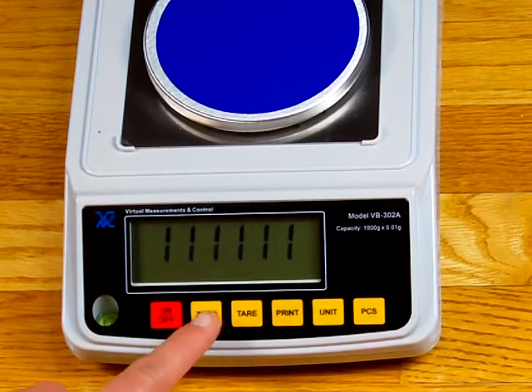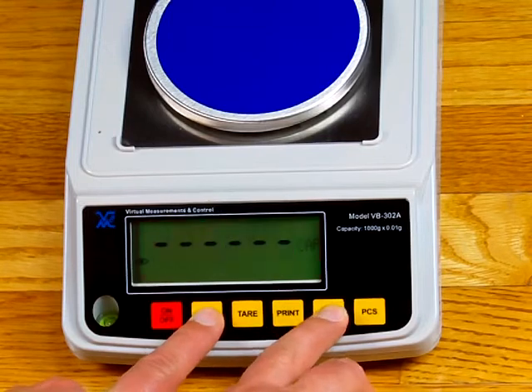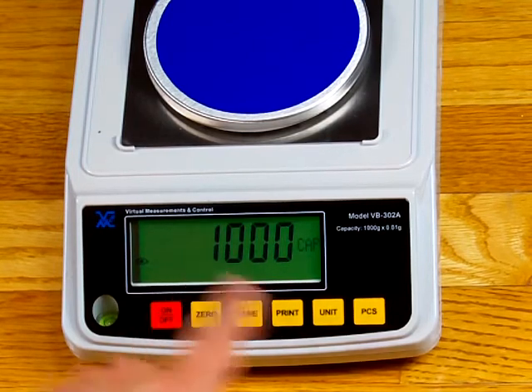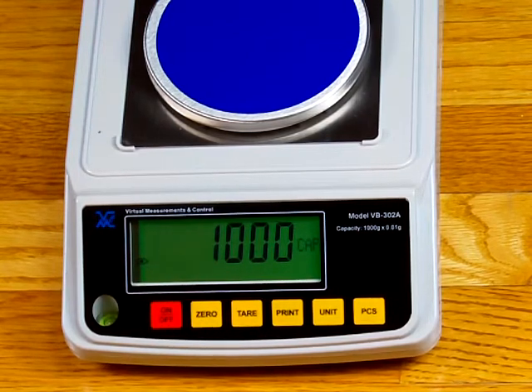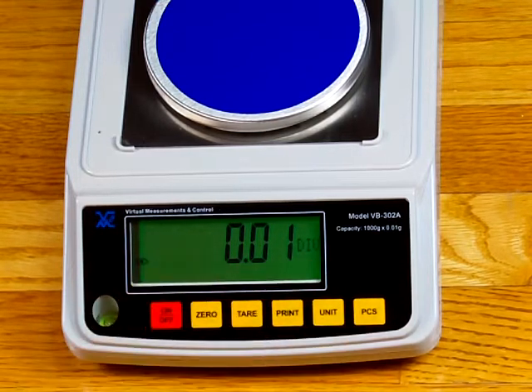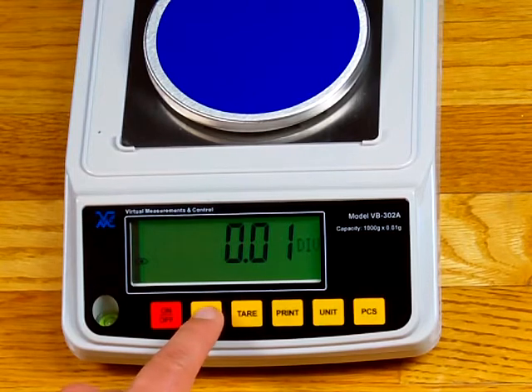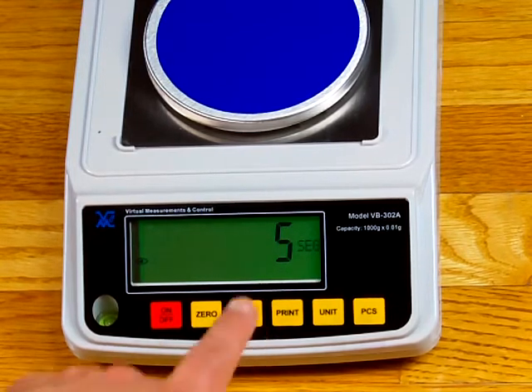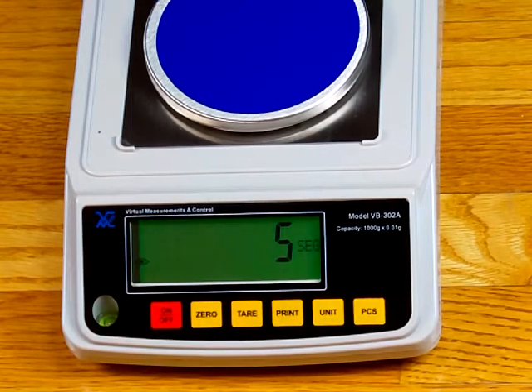So once we're there, we press the 0 and the unit key simultaneously. It shows 1,000. That's 1,000 for 1,000 gram capacity. One presses the 0 key. It's showing you the division is to 0.01 gram. Press the 0 key again. And here, it says 5, and it says over here, SEG. So this is a 5-segment calibration.